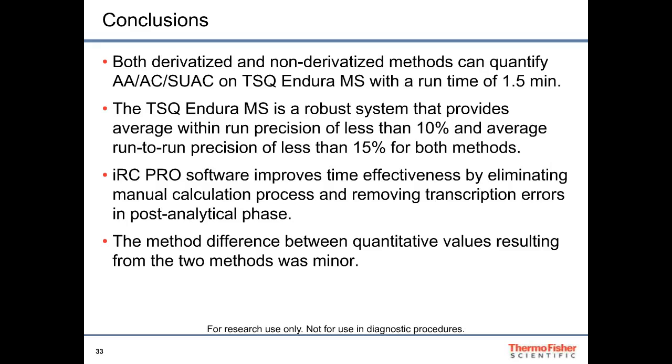Okay, thank you. Next question is, how about the method correlation for any specific analyte? So minor differences, one of them is less than 15%, were observed for the majority of the analytes between the two methods. But we do have the correlation graph for each individual analyte we monitored, but we just don't have so much room to show in this presentation. So if you want to see the correlation for any specific analyte, please leave your email address and let us know. We can certainly share the data with you.